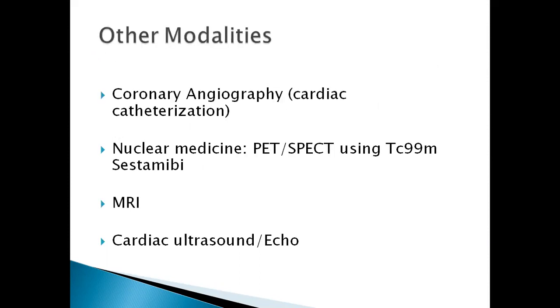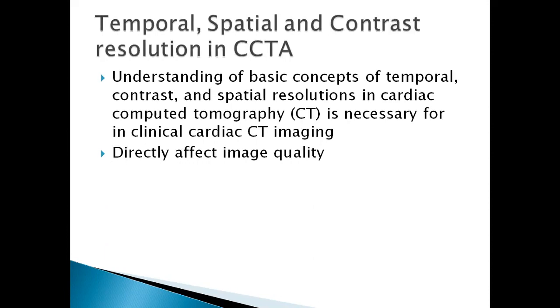Other modalities that can assess coronary arteries include nuclear medicine, which uses technetium-99, sestamibi, there's MRI, and there's also echo, otherwise known as the cardiac ultrasound.